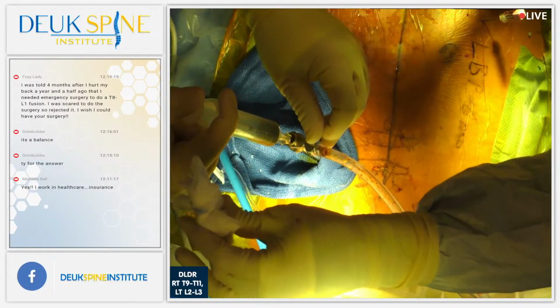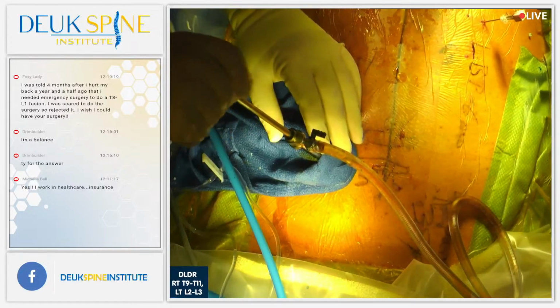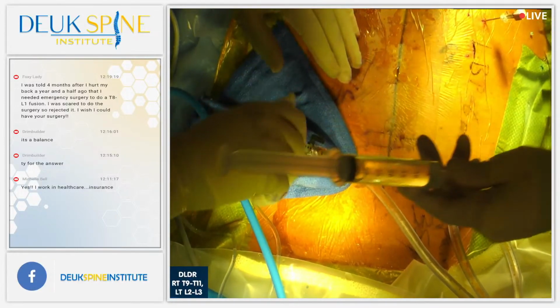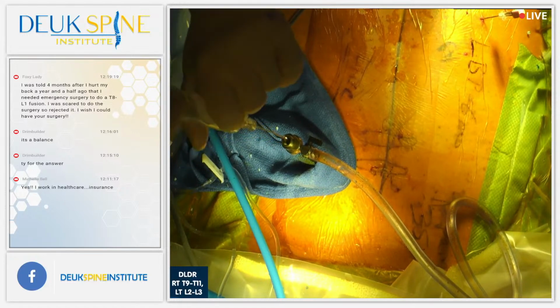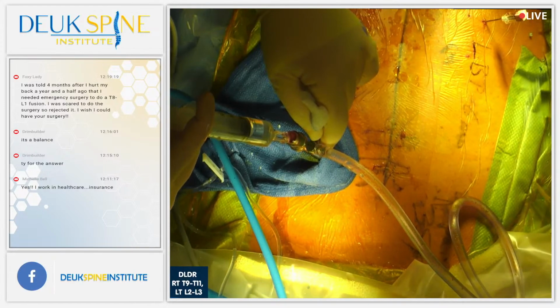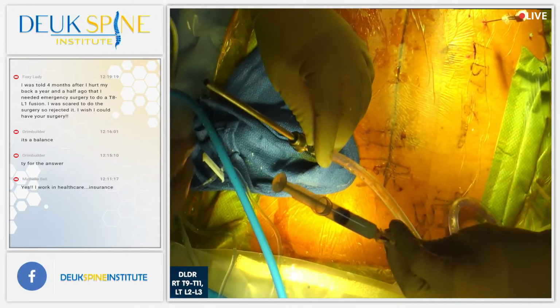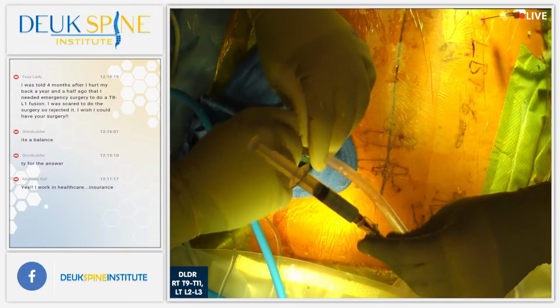All right, we're irrigating. We've completed treatment of 2 thoracic herniated discs, T9-10 and T10-11. You all agree? Thank you, Luis. Great job. Now we have 2 more surgeries after this, right? We have another thoracic, correct? And we have a, what, at the end? A lumbar? How many levels? 2? It's not that bad.